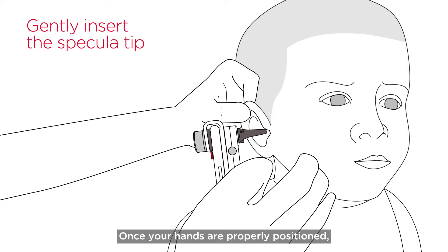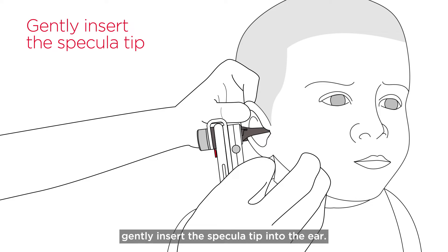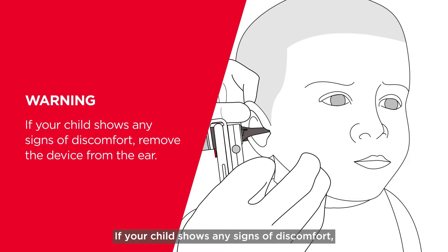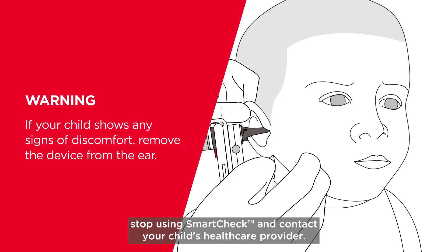Once your hands are properly positioned, gently insert the specula tip into the ear. If your child shows any signs of discomfort, remove the device from the ear. If you're using the wider specula tip, try switching to the smaller, thinner tip. If your child is still experiencing discomfort, stop using SmartCheck and contact your child's healthcare provider.